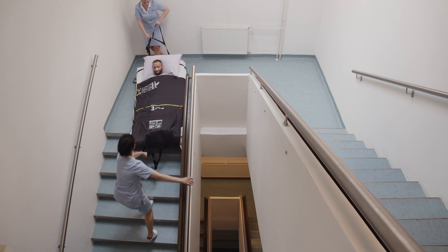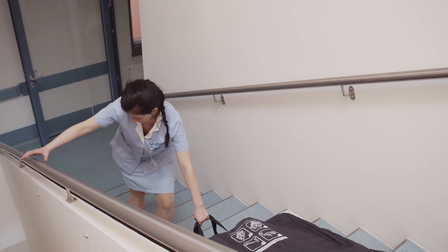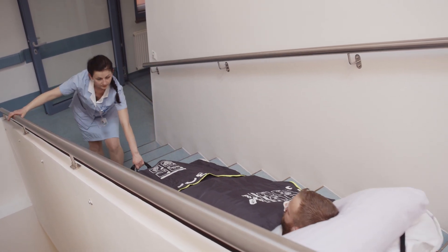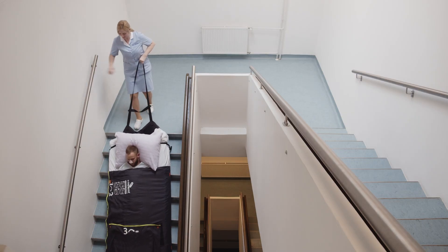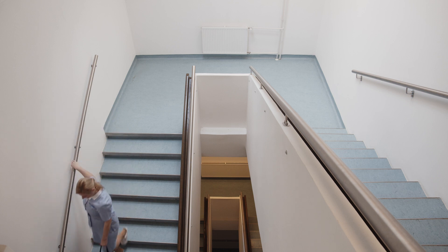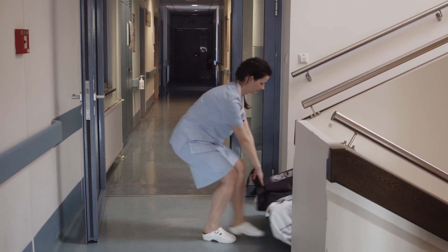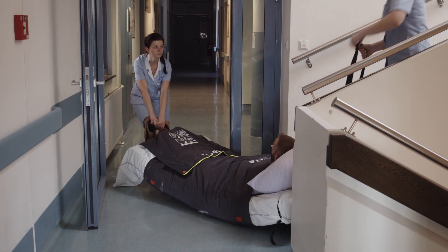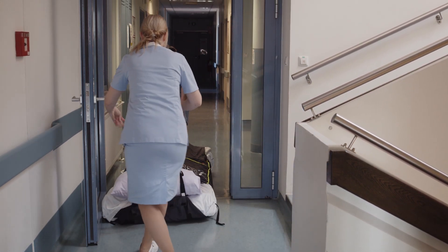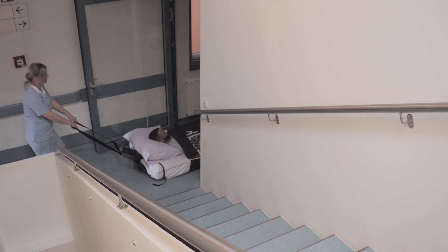In case the staircase is wide, you can step to the side and put the patient down when his whole body is on the stairs and no longer on the floor. The patient lying on the mat will then slide down the stairs. Walk behind the patient, hold firmly the pulling belt, and transport the patient to safety. If the evacuation is performed by two persons, one of them may be responsible for the necessary braking and turning when sliding the patient down the stairs using the head belt of the evacuation pad.